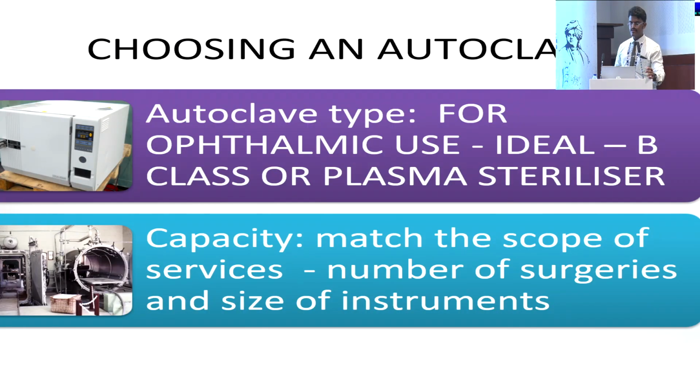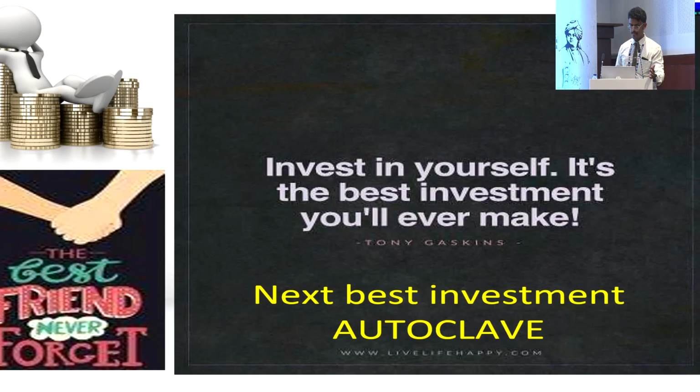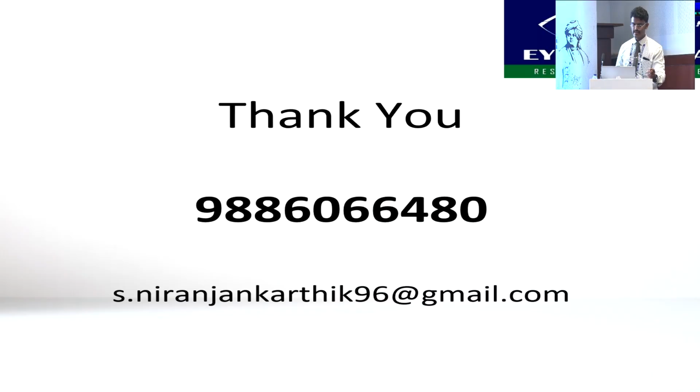And lastly, to give a rough idea of choosing an autoclave, for ophthalmic use, the ideal would be to choose a B class or plasma sterilizer. And the capacity should match the scope of your service and your practice demands. So invest in yourself. It's the best investment you will ever make, and the next best investment would be your autoclave. Thank you.